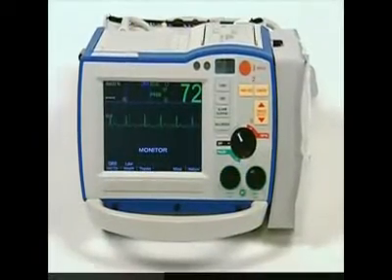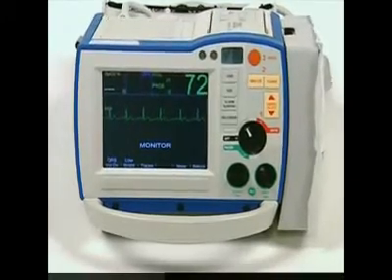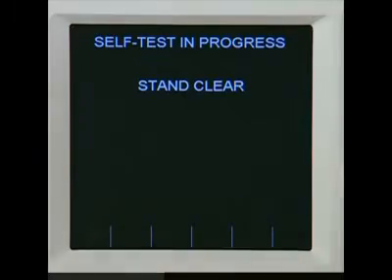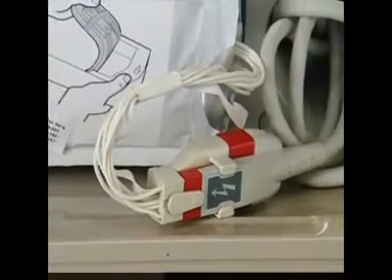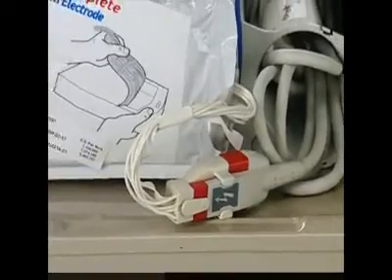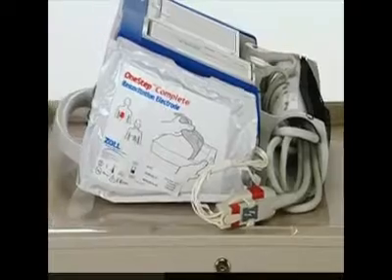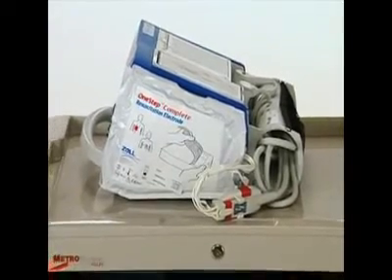Finally, the R-Series maintains a constant state of clinical readiness by offering an unprecedented level of daily automatic testing. Most importantly, testing will occur while the one-step cable is connected to electrodes or paddles, so it is not necessary to compromise clinical readiness by using a separate test block.